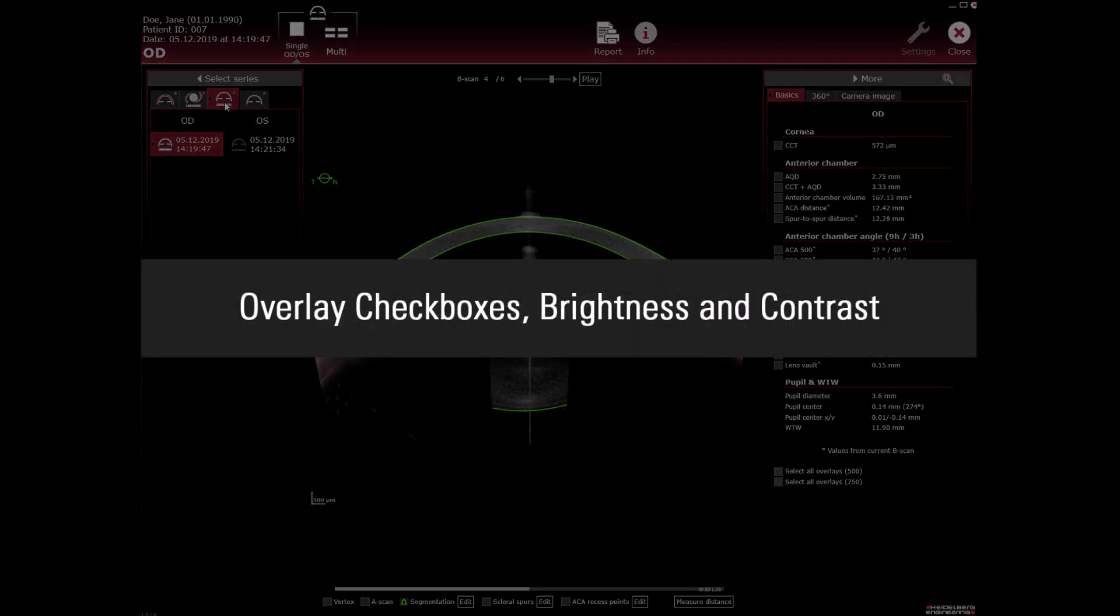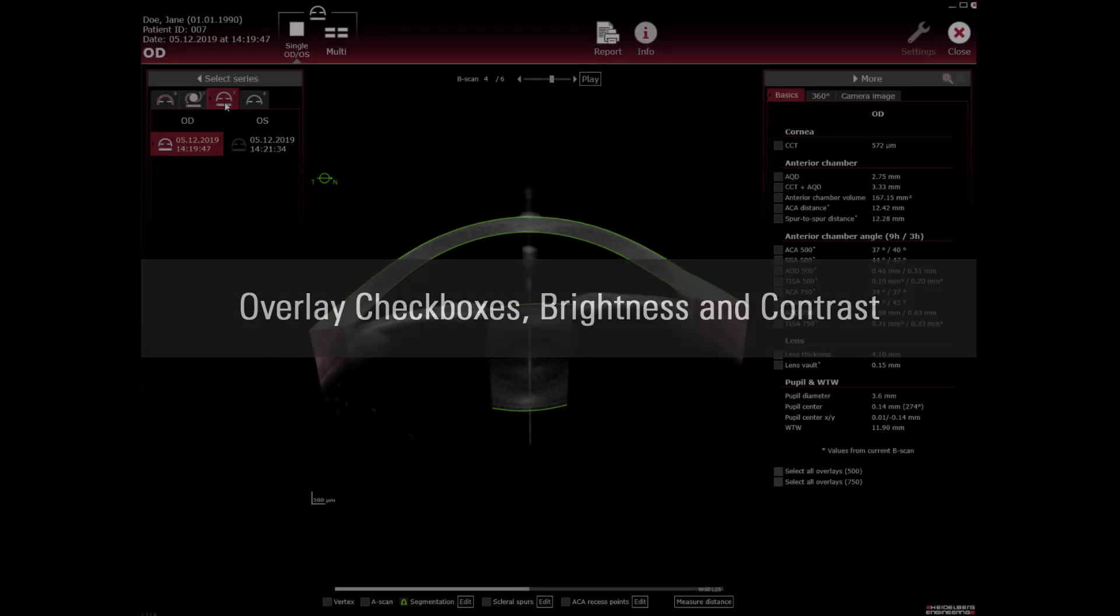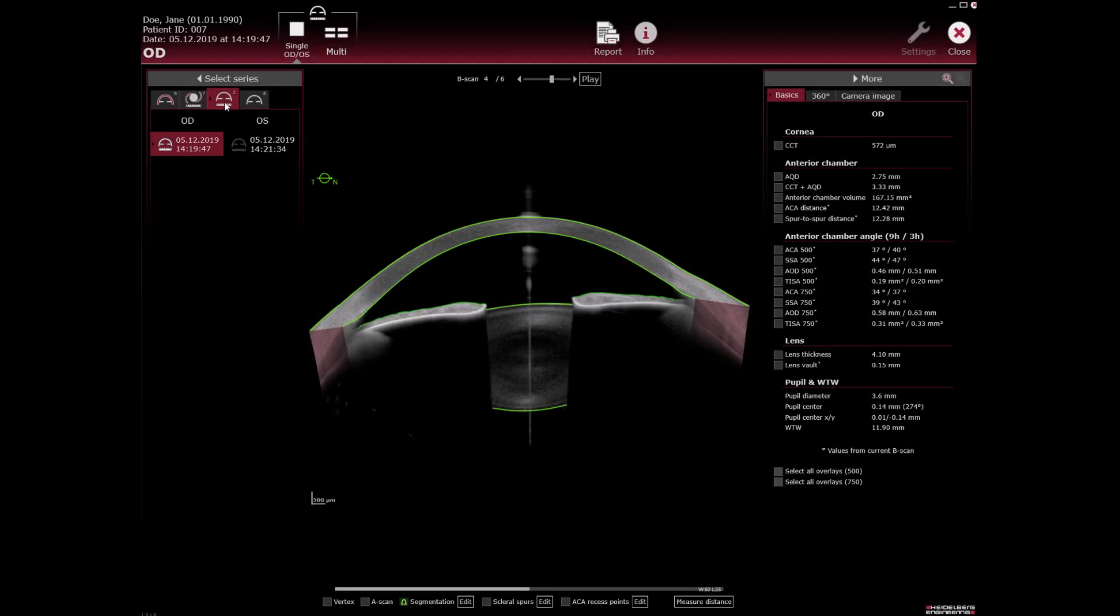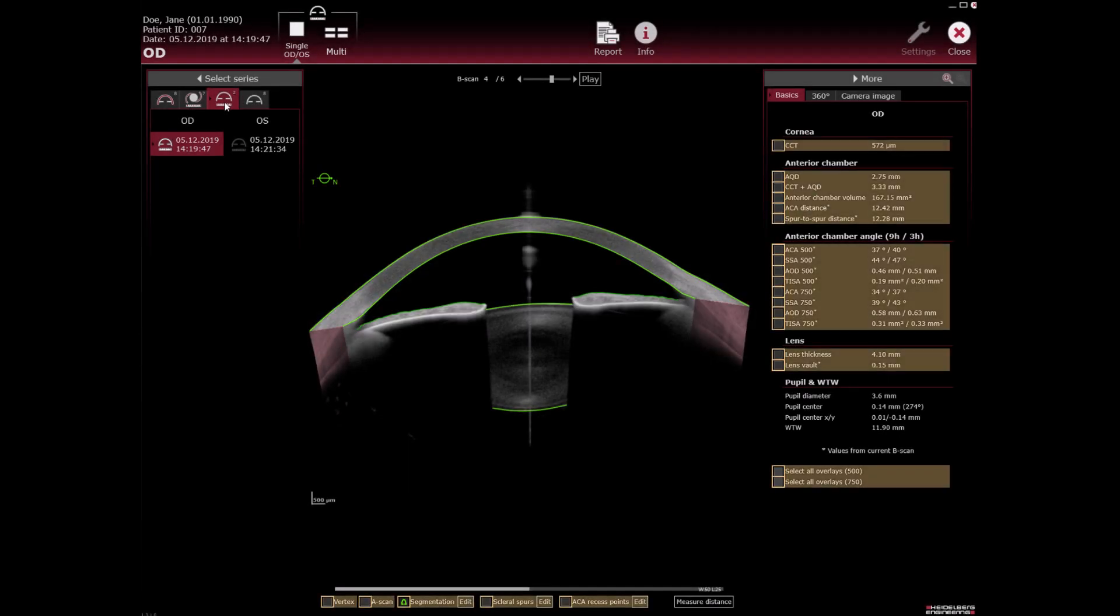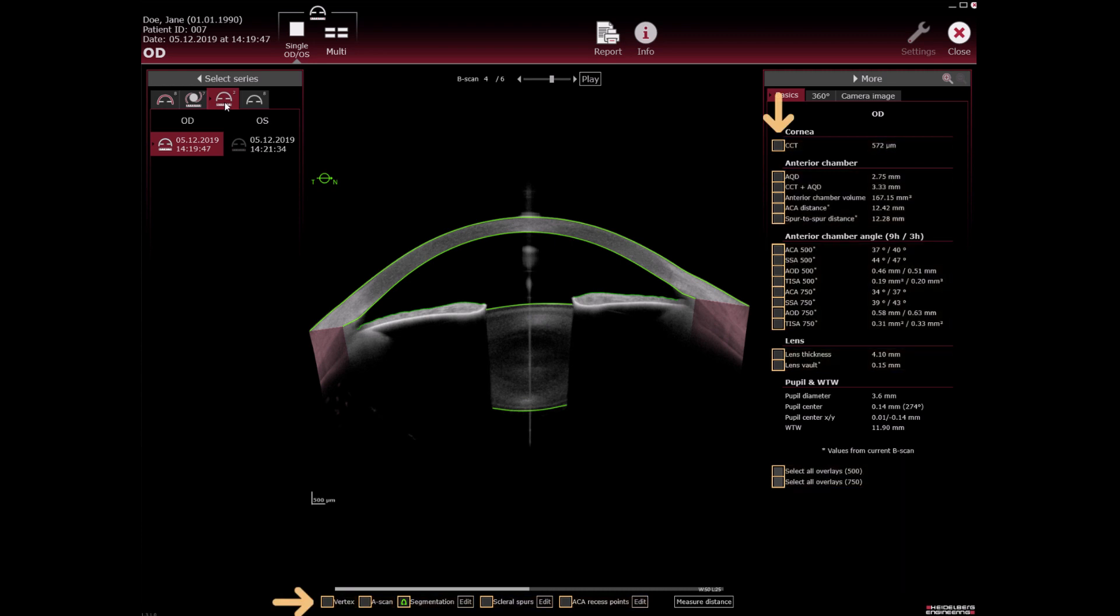Overlay checkboxes brightness and contrast. Various parameters can be superimposed as overlays on the OCT section or camera image. Select the checkbox next to the overlay.